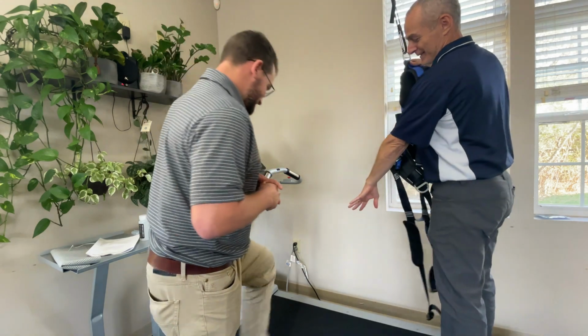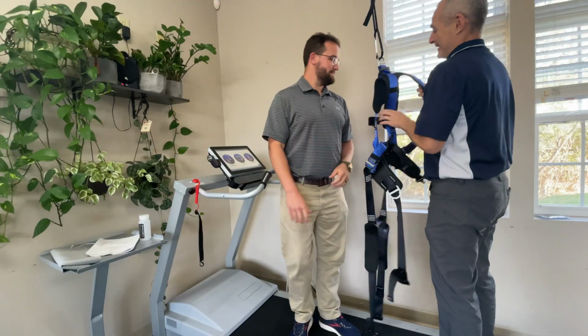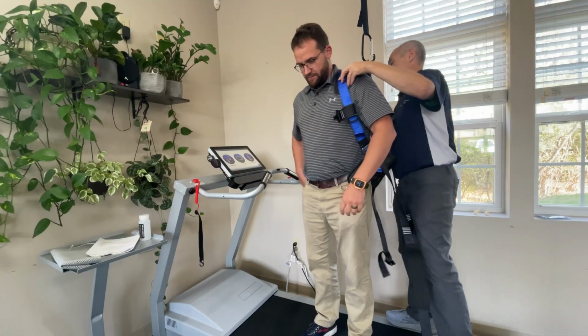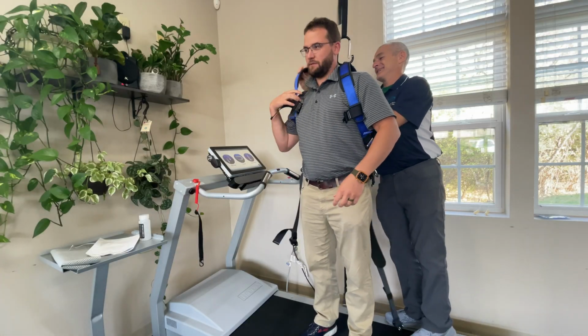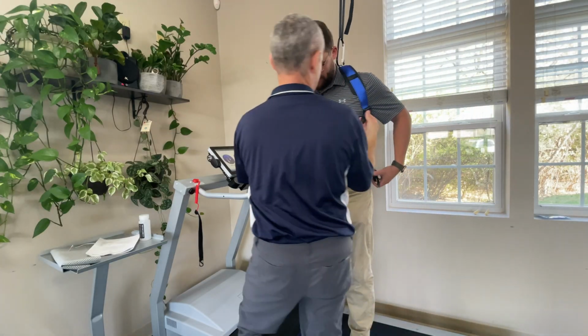Usually the way I've been doing it, I'll get my patient to step up there. I'll get them to turn and face me. We'll get one arm in. And then I'll get the other arm in. Yep, there we go.